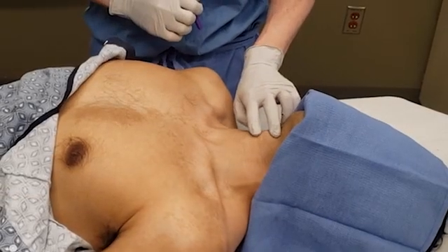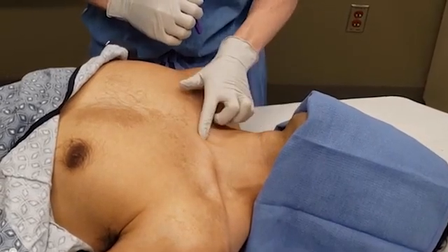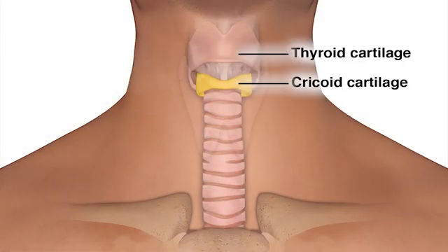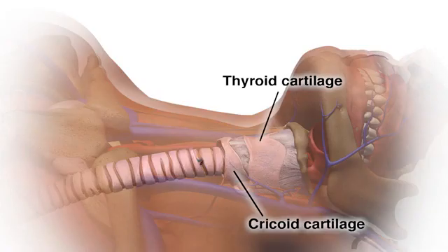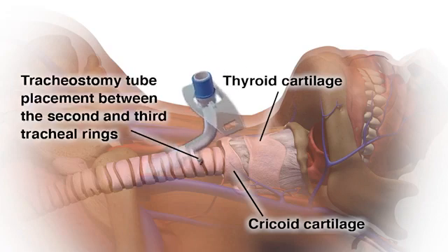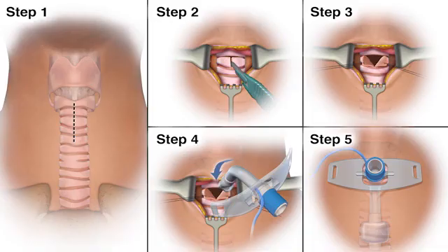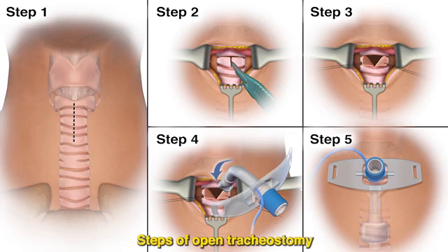Palpate the patient's neck to identify key anatomical landmarks. These include the thyroid cartilage, the cricoid cartilage, and the sternal notch. The ideal location for placement of the tracheostomy tube is between the second and third tracheal rings. Make sure to check for a high-riding innominate artery that may overlie the area of the planned incision. An open tracheostomy should be performed instead of percutaneous tracheostomy if the patient has a high-riding innominate artery.